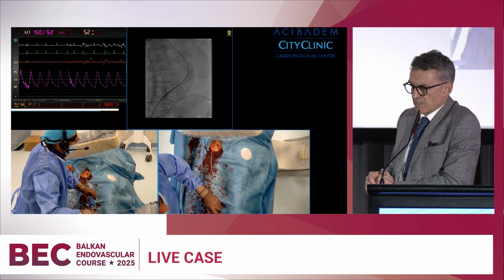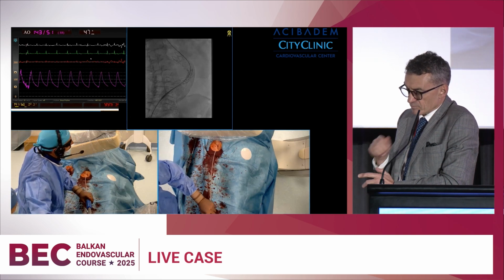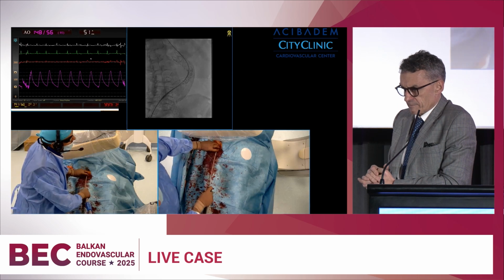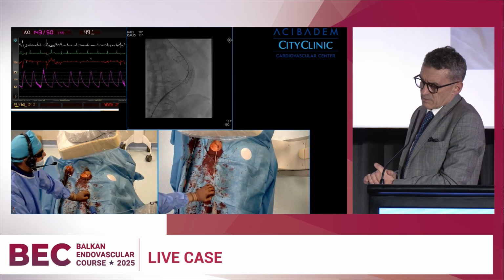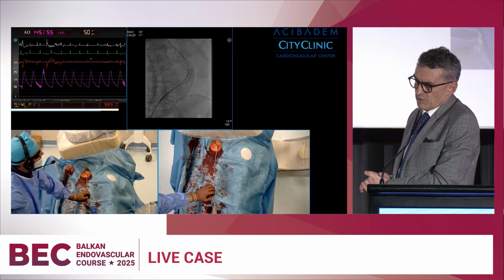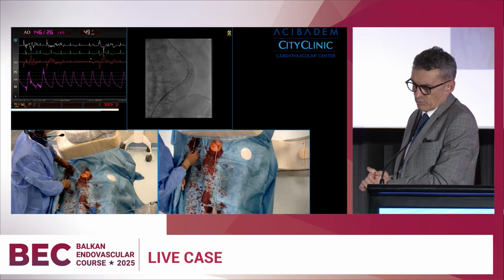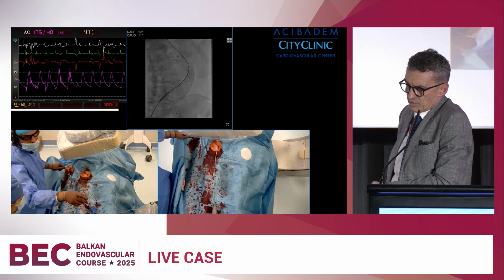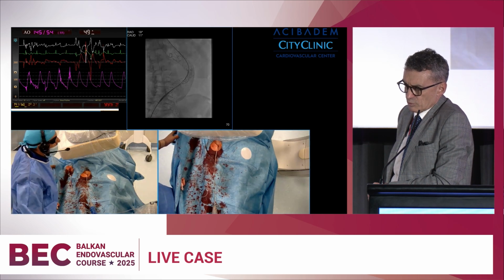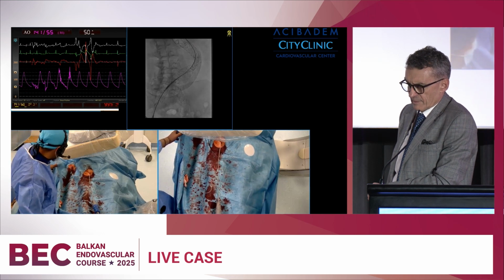Are you going to make a gentle post-dilation balloon? Yes, it's a very good question. What do you think? Is it necessary? I would advise, as in other cases, to put the pigtail just above the free flow and make an injection in a contralateral projection to see the result and decide. In case there is a full interruption of the endoleak, you don't need post-dilation. We are ready for the angio to see the result.